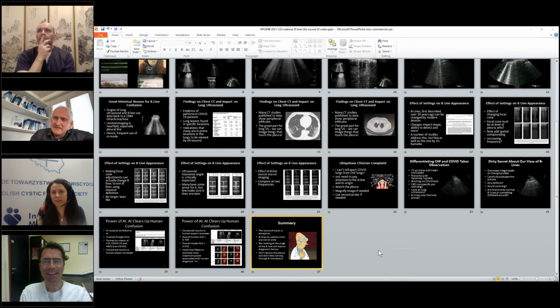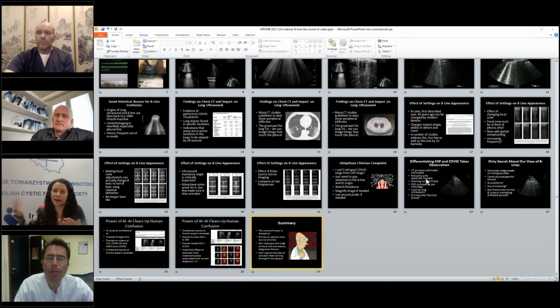So when I need the differentiation, for example, ultrasound of the mediastinum, or have doubts about the upper parts of the abdominal cavity, I ask the radiologist, and we perform the examination together, so that we make a consultation in real life to focus on the patient and to collect the knowledge from clinic and the knowledge from radiology.